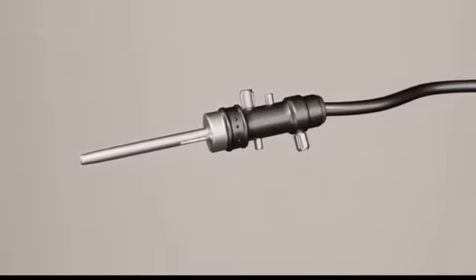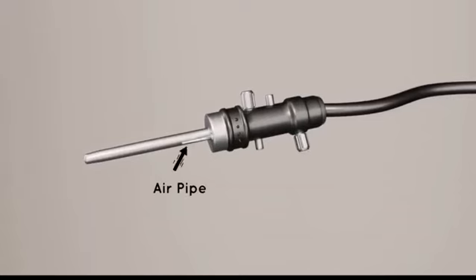Air pipe. The light source box also contains an insufflation air pump. The air is sucked from the light source box through one or two holes in the air pump and pushed from the air pump into the air pipe of the endoscope through a plastic tube. Because the air pump does not have a dedicated HEPA filter, transmission of microorganisms cannot be excluded.